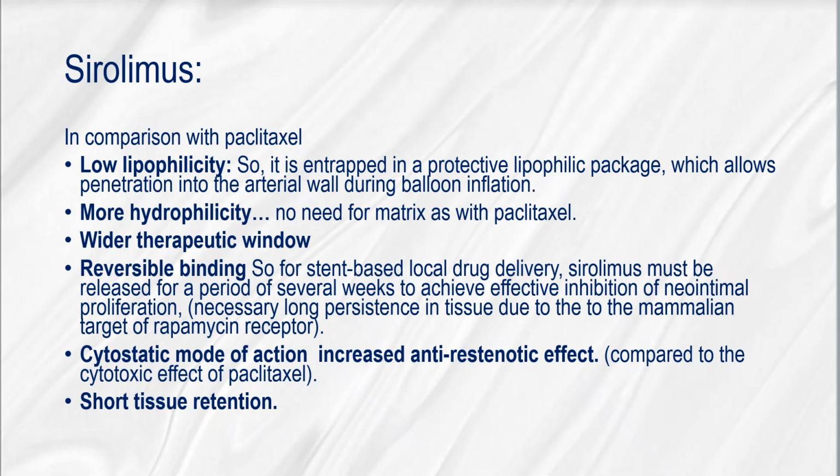Sirolimus is now used in new drug-coated balloon designs. In comparison with paclitaxel, it shows low lipophilicity, so it is entrapped in a protective lipophilic package to allow for penetration into the arterial wall during balloon inflation. It shows more hydrophilicity, so there is no need for a matrix as with paclitaxel in some designs. It has a wider therapeutic window and a cytostatic mode of action, so with better increased anti-restenotic effect compared with the cytotoxic effect of paclitaxel.